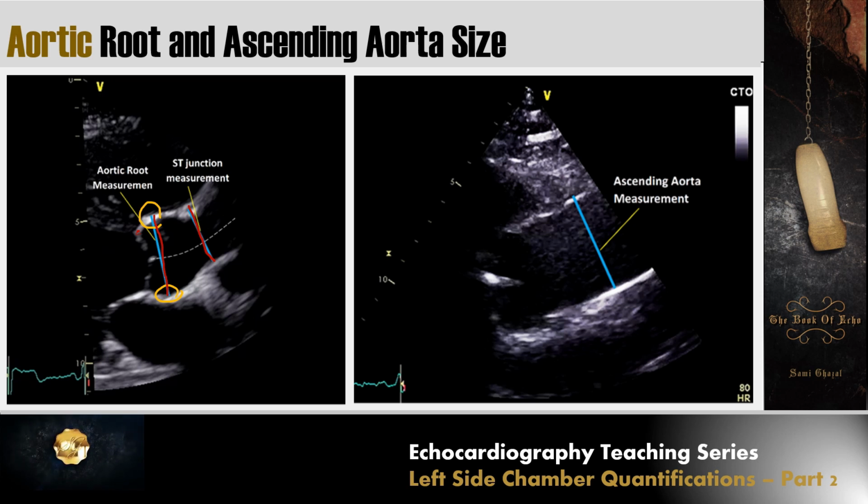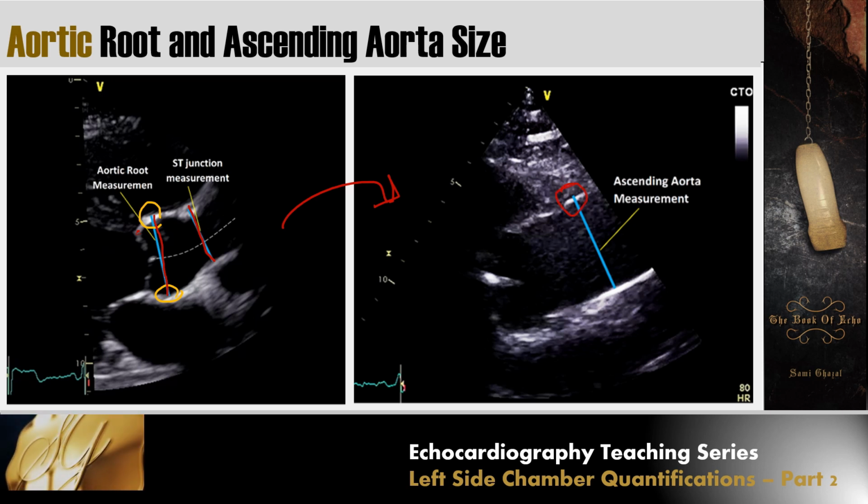Okay, so now after measuring the aortic root, to measure the ascending aorta, usually you need to move the probe a little bit closer to the sternum, or by a little bit tilting the beam toward the sternum to get the ascending aorta in the view. Again, we measure it in the same manner, leading edge to leading edge, outer edge to inner edge.